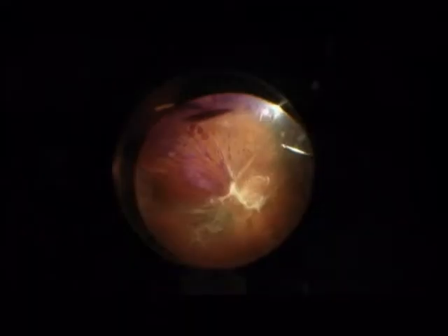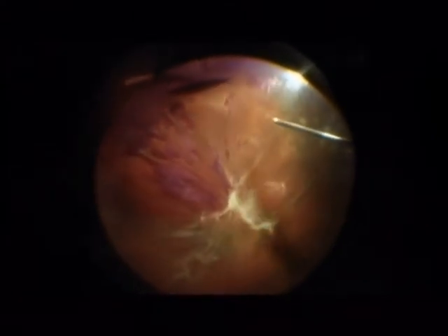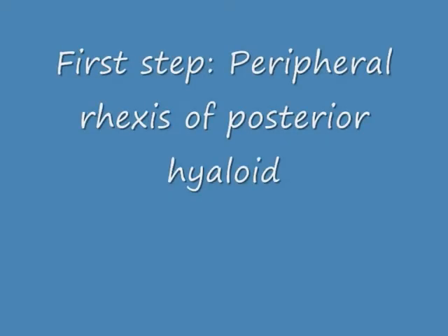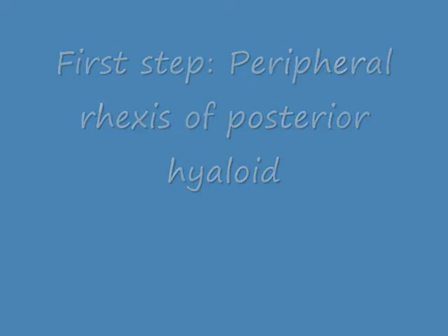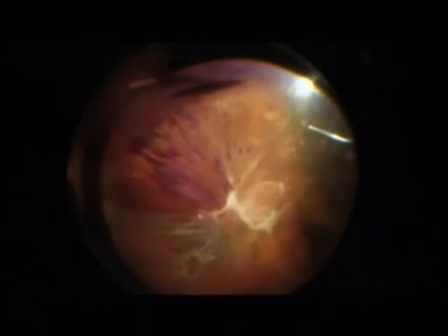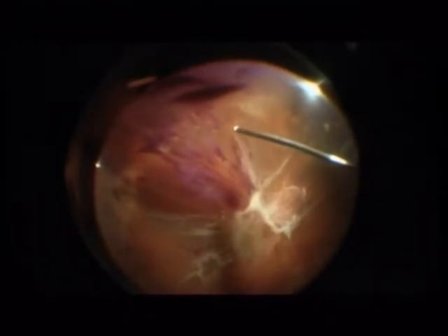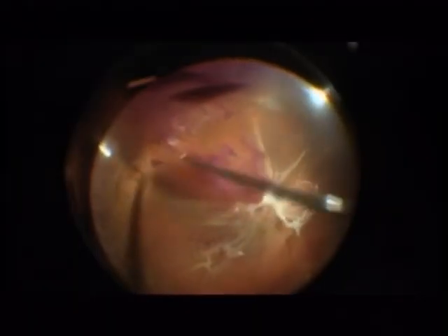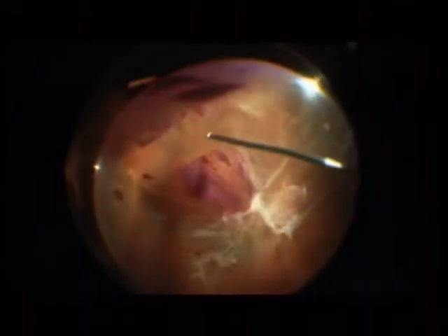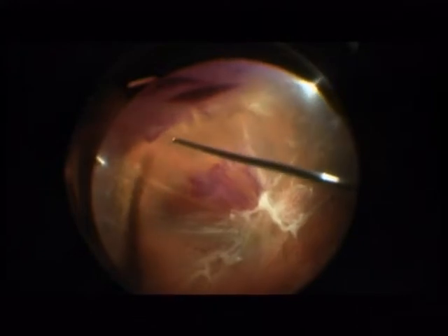This is my typical setup for diabetic eyes: 27 gauge vitrectomy. The first step is a peripheral rexis of posterior hyaloid, which means that we open up the posterior hyaloid at the height of the equator. You see it very nicely in those parts where there is hemorrhage behind the posterior hyaloid, like here in the inferior pole.